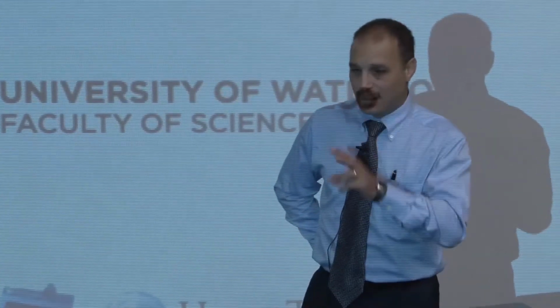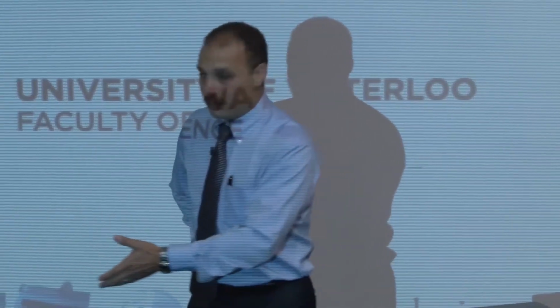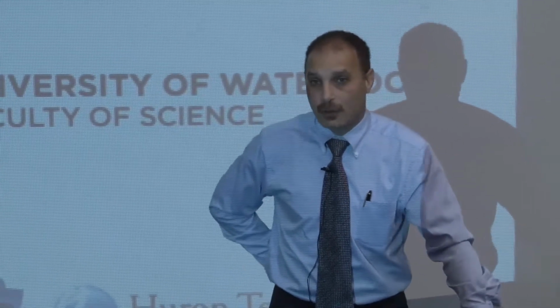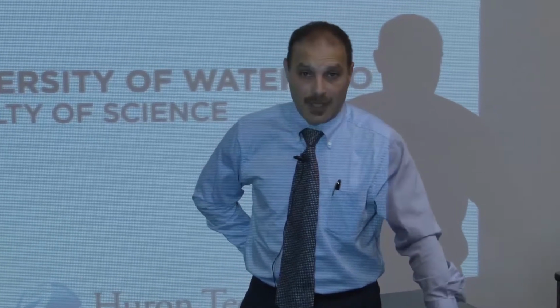No, absolutely. You're definitely touching on one of the areas that is now having to take center stage because it was not before. At least I can think very quickly of two ways. One of them is one of the potential collaborations we have with one of the researchers here at the University of Waterloo, I think with Catherine's group, which is selective sampling. Even though we can get to a very high resolution, we can do selective and intelligent sampling. So you only get the data that is going to be relevant so that you don't waste your time with the 90-some%, maybe 99% of the data that's useless.